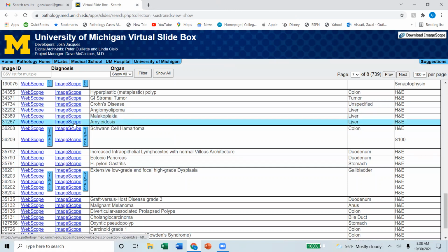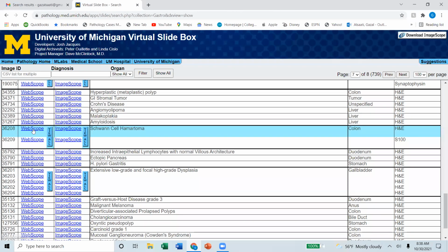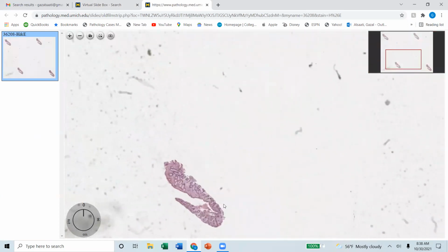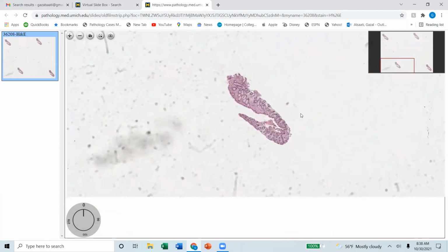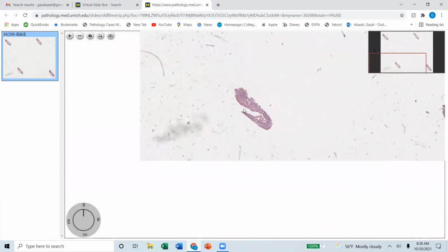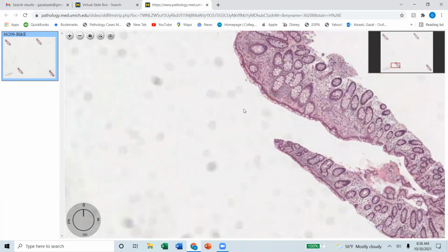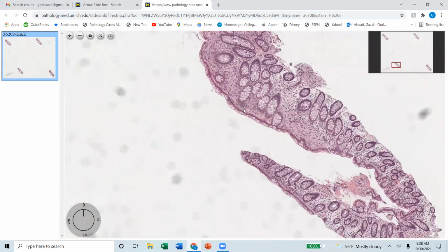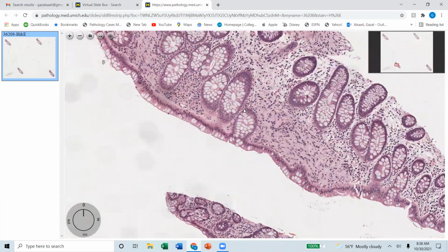Angiomyolipoma. No, okay. Colon Schwann cell hamartoma. Okay. By far my favorite subtle, non-significant finding, but I feel so proud and happy when I make it. It is really not significant, but to be able to pick it up, I really find very much joy in it. Okay, this one.